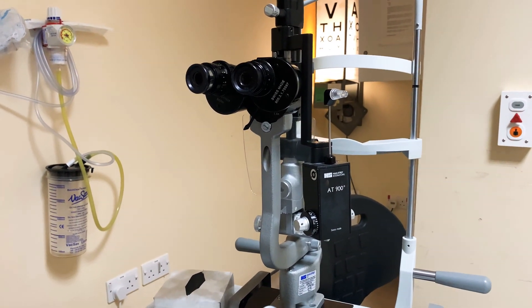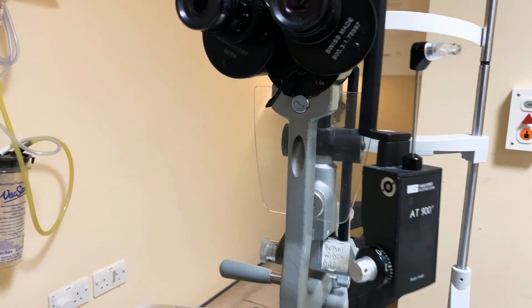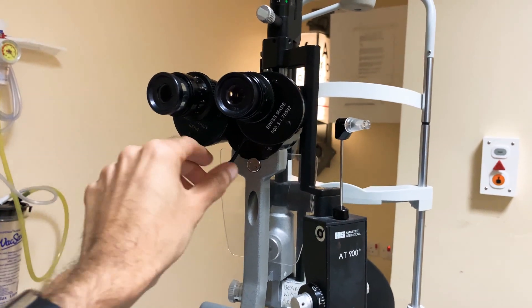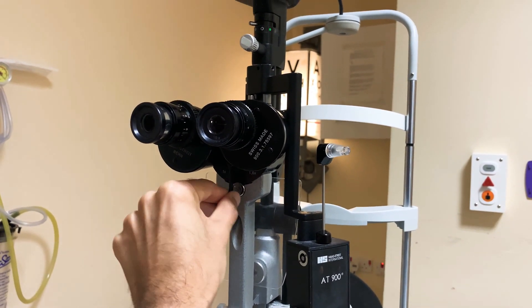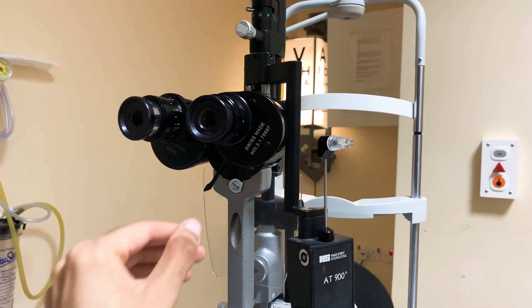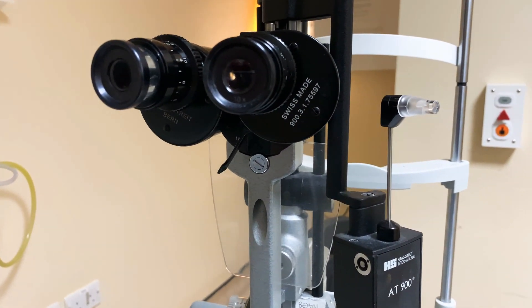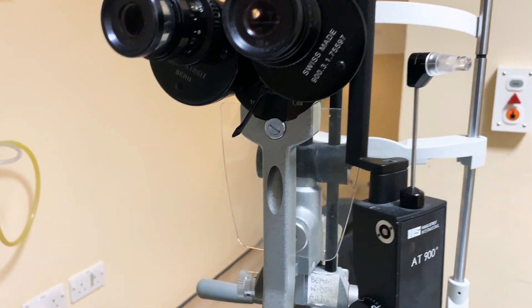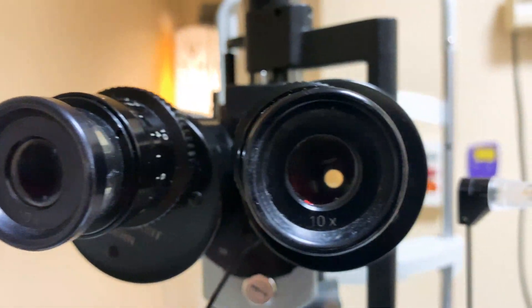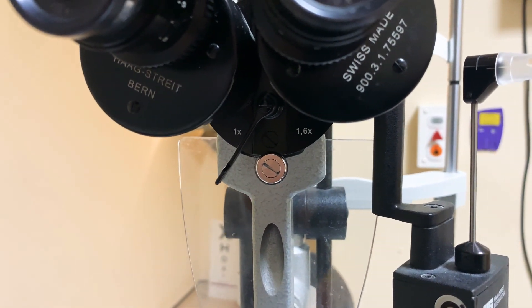That brings us to magnification. About half the A&E registrars surveyed actually knew how to change the magnification. It's this lever here — you just go 10 times and 16 times. I'd recommend starting with 10 times to get a good view of the overall structures, then zoom in with 16 times if needed. The eyepiece is 10 times, so the markings of 1x and 1.6x actually correspond to 10x and 16x.